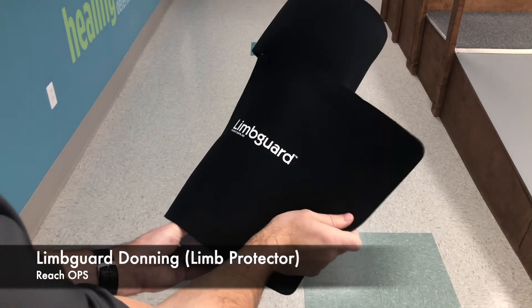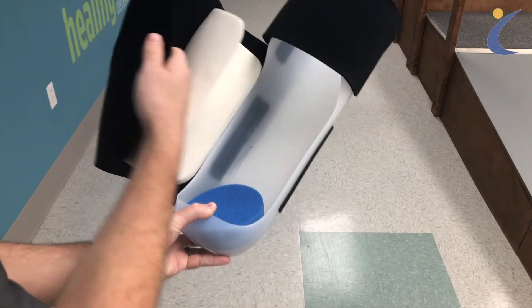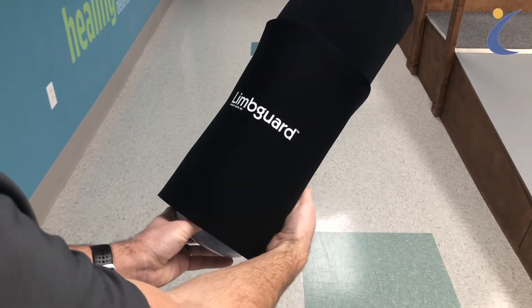A limb guard is a post-op limb protector used to shape your leg in preparation for a prosthesis, prevent muscular contractures, and protect against bumps and falls.